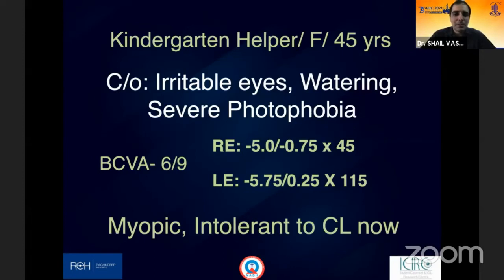She's been a myope since a very young age and a contact lens user, and now finds it difficult to tolerate contact lenses. She came to us for an opinion on clear lens extraction because she's never worn glasses all her life, and she likes to be seen without glasses. And now, because she's not able to tolerate contact lenses, she's having to wear glasses.